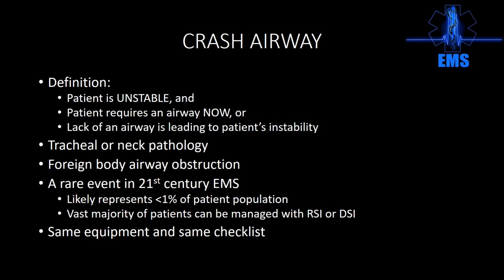You'll know it when you see it. But you still have the time to get your gear ready, and the way you lay out your gear largely can accomplish this intubation checklist. I'm going to throw it up there one more time so that people see it.